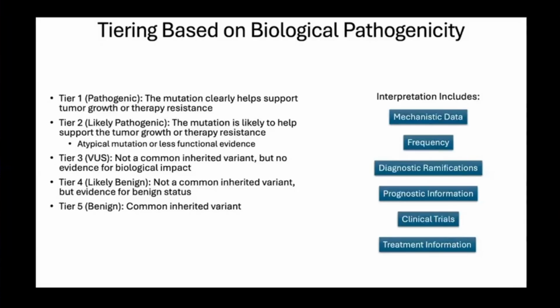And perhaps most importantly, I feel like this kind of system is a bit more in keeping with our role as pathologists, because a large part of what these panels are about is real pathology practice, helping to make the right diagnosis for the patient. And so our reports should focus both on treatment possibilities and also on what's important from a pathology standpoint.